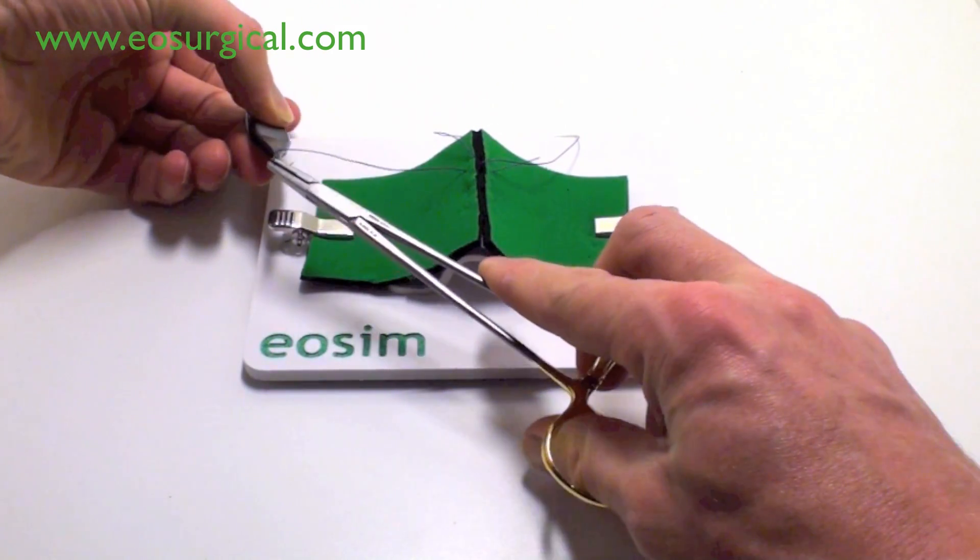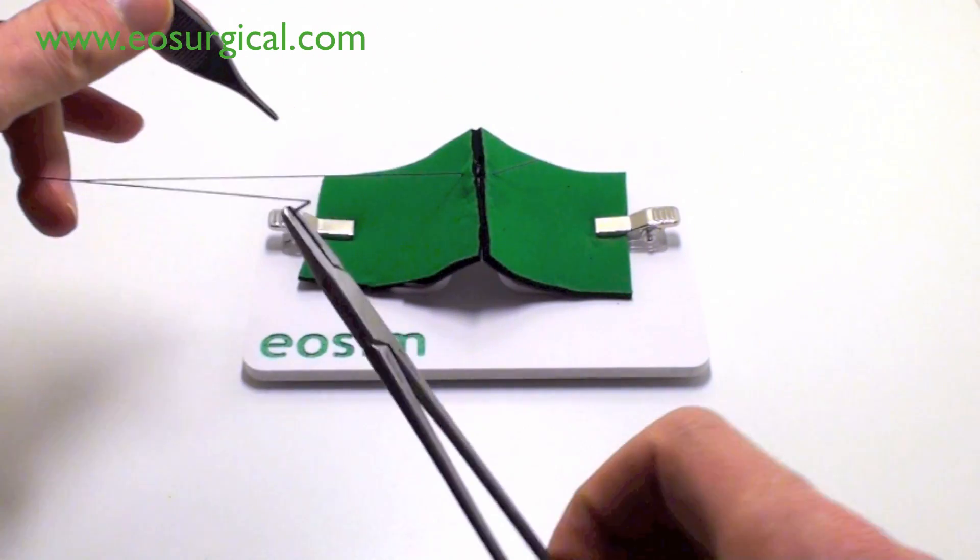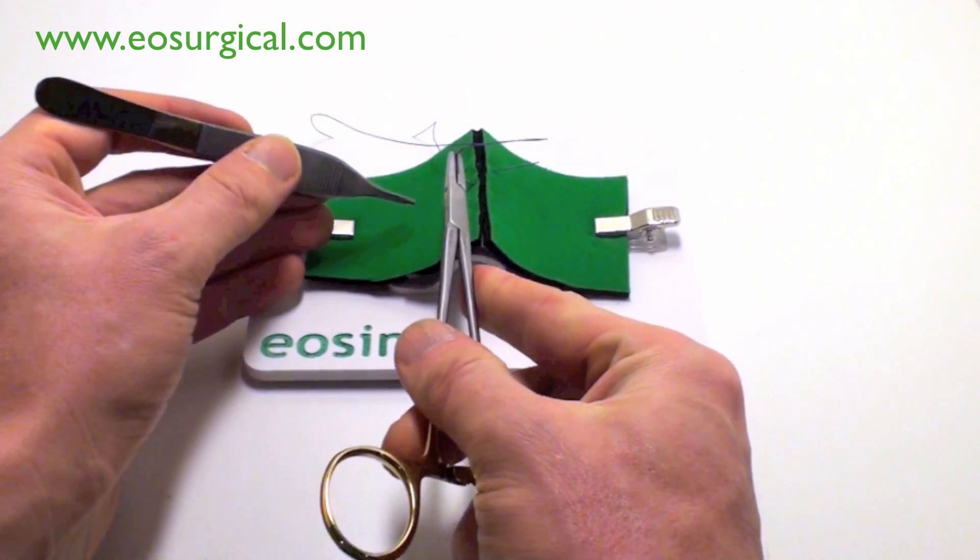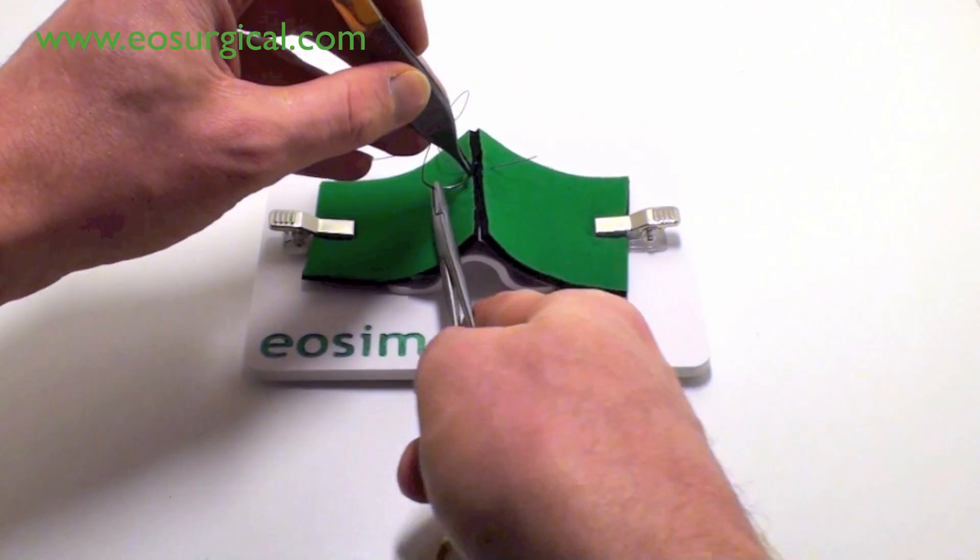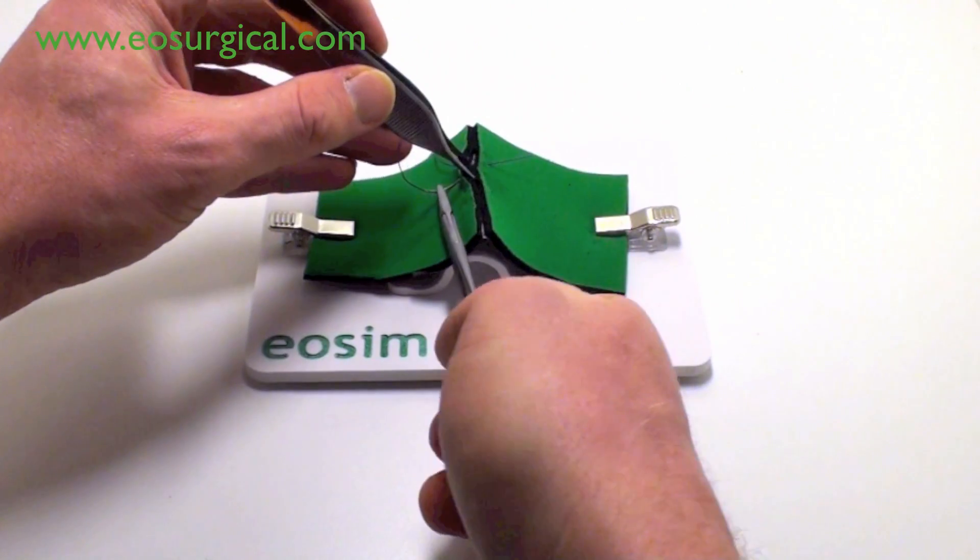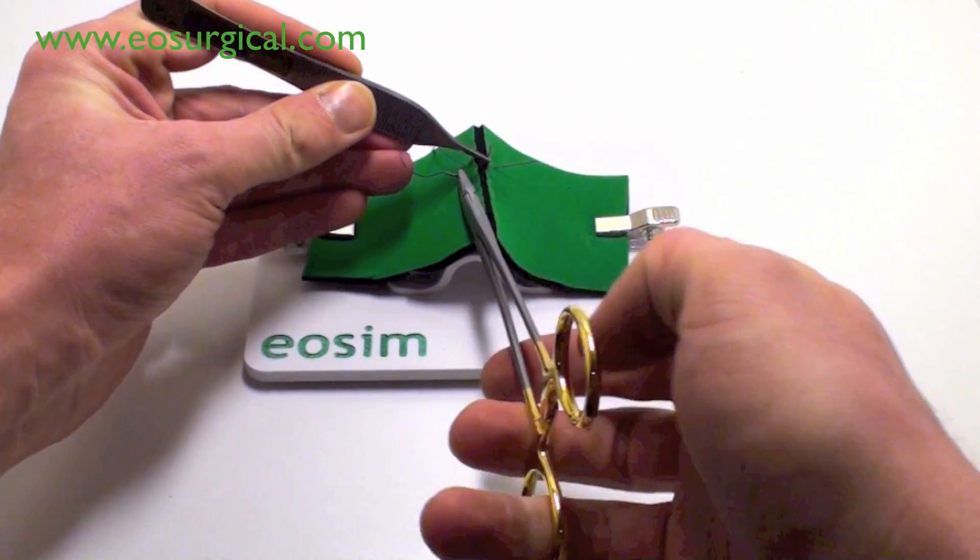There's almost a full pronation to supination of the hand. And again, that's a maneuver to reverse needle. It goes past back through the tissues.